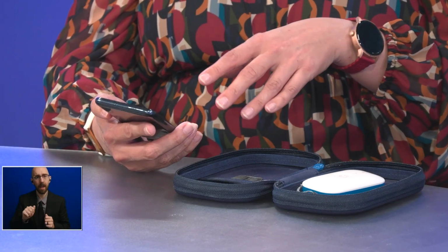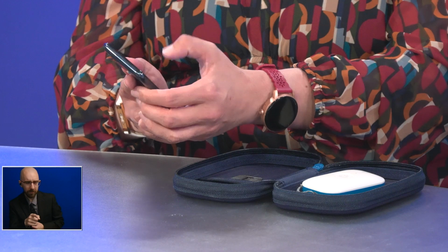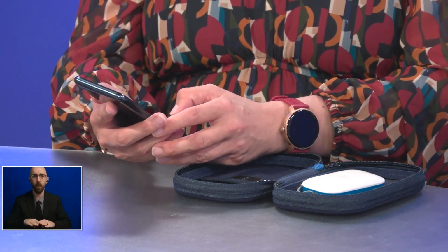If I'm getting an MRI of my brain or something, I'm able to turn the device off with the phone and other things like that. We can allow the ability for the person to turn it up or down on their own, or off, as she said. That's fantastic. It says that the DBS is open for me to open it, and it gives me different options of what I can do. And that must make you feel really in control. Yes, it gives me a lot more control feeling than I've been used to in the past.